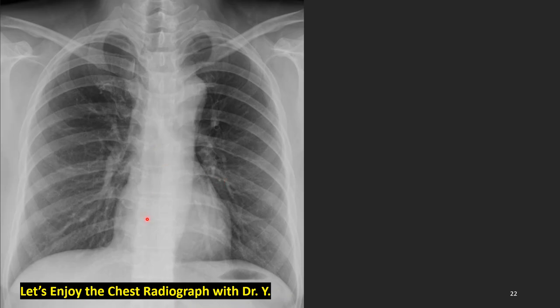What do we see here? You got it? Peripheral lung looks okay. Yes, it's very difficult, so I'll tell you first. How about the left side of the tracheal inner lumen? Continuous? No, not continuous. Something wrong here. Bulging contour inside the left tracheal wall. Yes, tracheal mass, tumor.